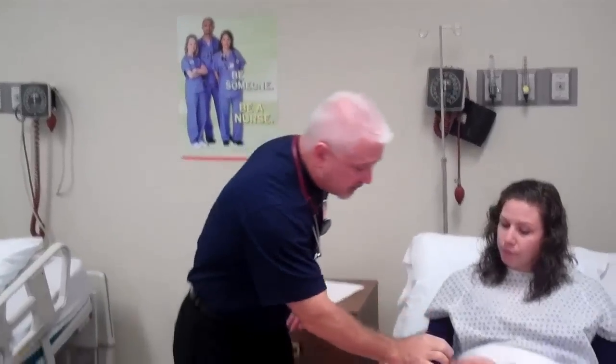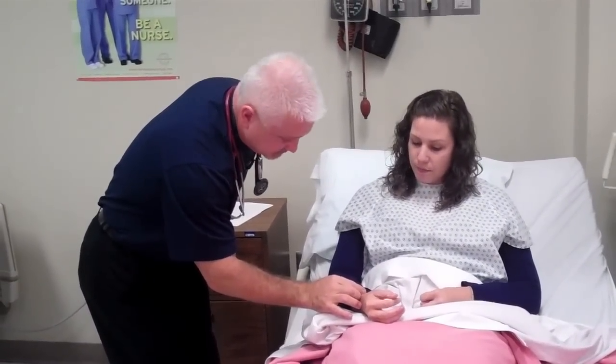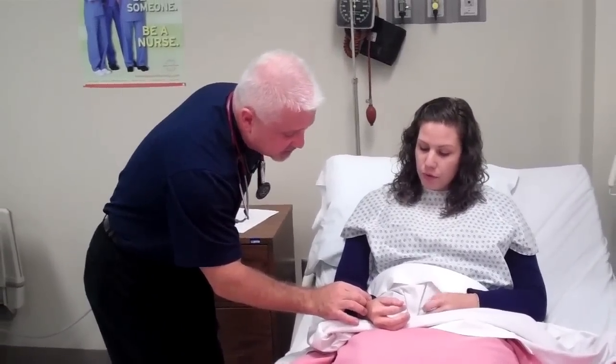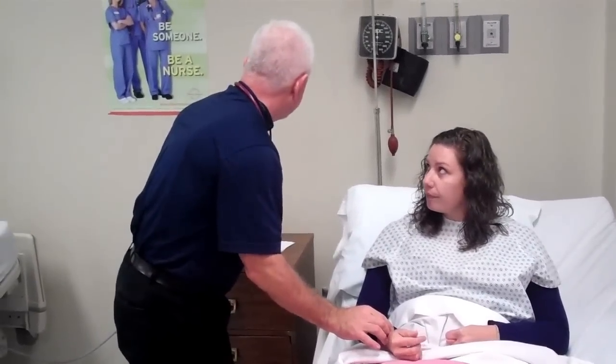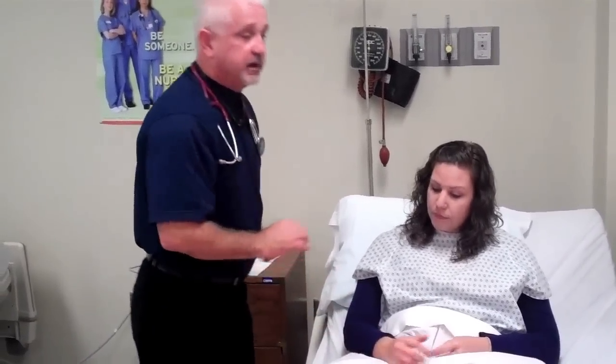I'd explain that her doctor has ordered oxygen because she's been feeling some shortness of breath. I'd come over and check her ID: 'You are Ms. Savannah Hatch, and your date of birth is 4/28/89?' Her medical record number and patient identification match up, confirming I have the right patient.